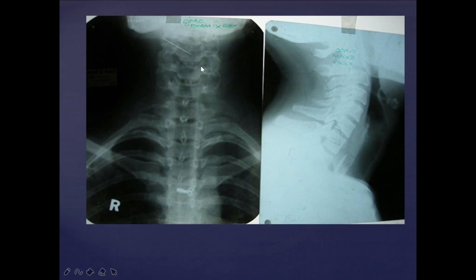It's foreign bodies in the esophagus. So here you can see again foreign body, chicken bone or mutton bone. This is also one of the commonest foreign body in the adults. Usually coins you will see in the children. So this is again sharp needle in the cricopharyngeal sphincter, the upper part of the pharynx.